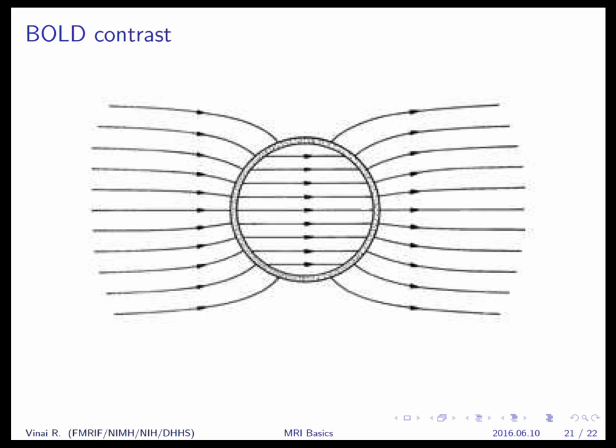So they'll be more or less lined up and the signal will be adding coherently, then you get a strong signal there. And you won't have this background weighting, this T2 star weighting. Now, as Peter hinted in his first talk, the fortuitous thing that made this work is that when a brain region becomes active, there's actually an oversupply of oxygen, nutrients. So what tends to happen is the blood oxygenation actually increases in areas where the brain is active.